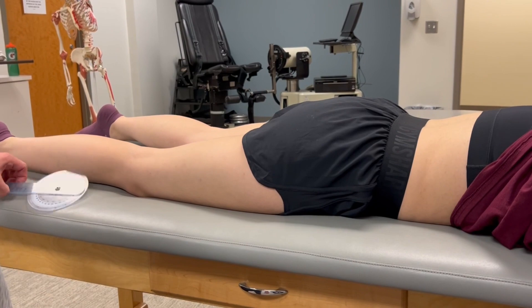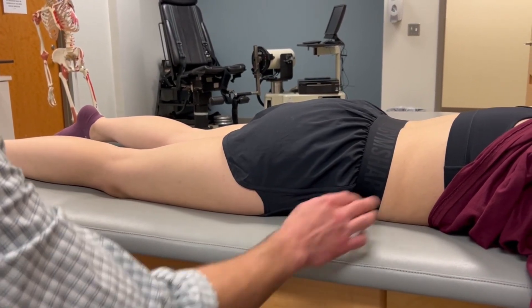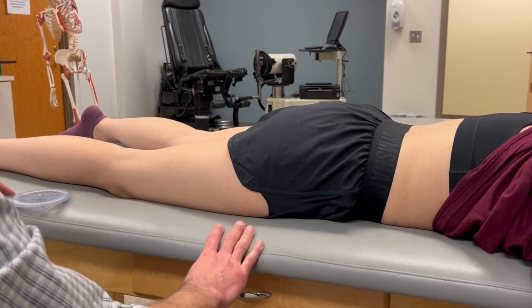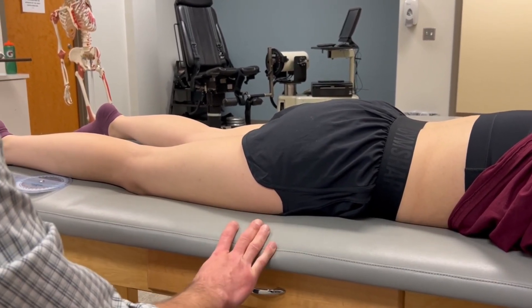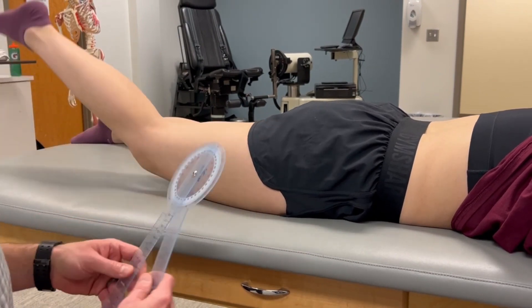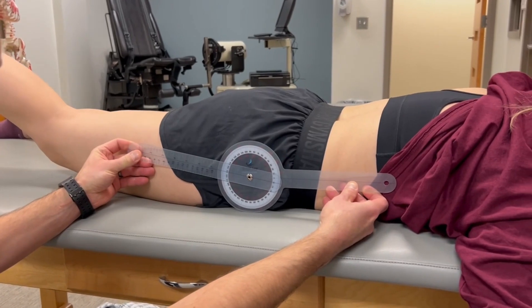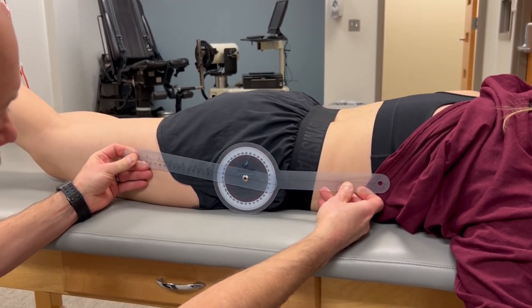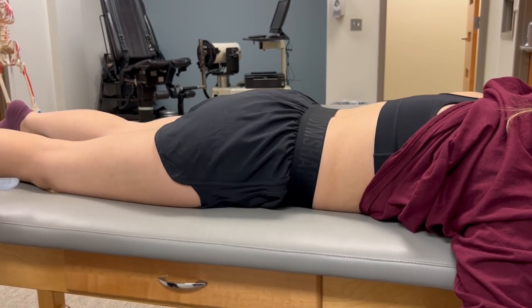Hip extension active and passive range of motion: our zero position or starting position for this measurement is where the lateral midline of the trunk is parallel with the lateral midline of the thigh or the midline of the femur. We have the patient raise their leg up off the table as far as they can go — this is our active range of motion measurement. We can also measure this passively.